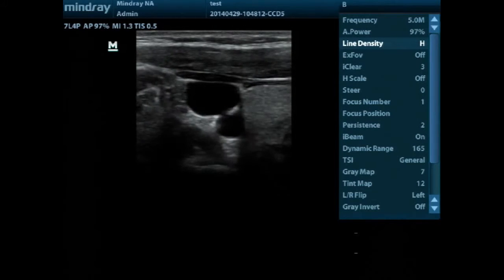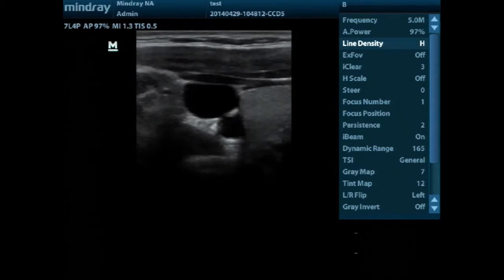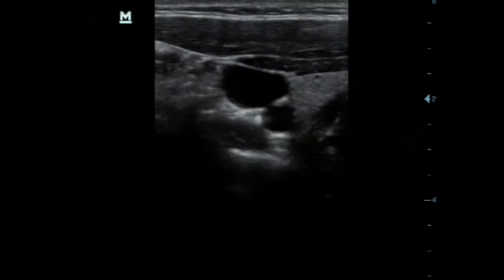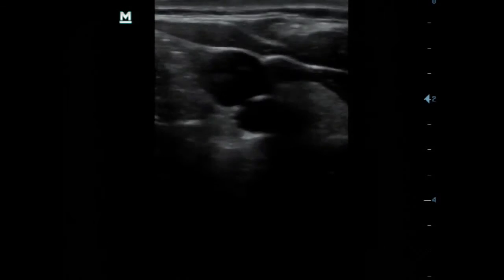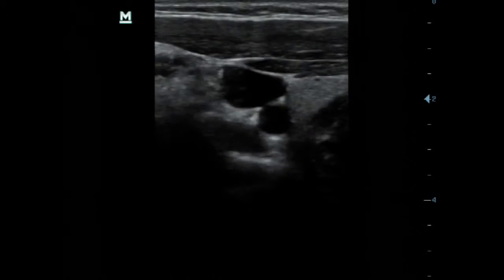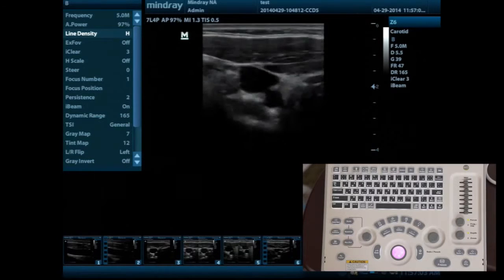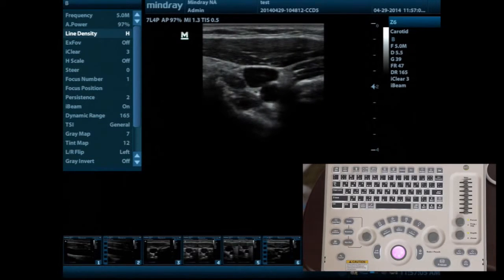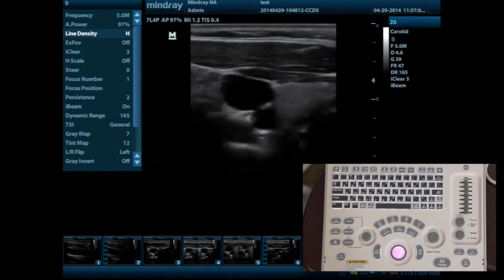So you're not zooming in, so you don't lose any pixels. It actually keeps the image nice and sharp. And so this is like a medium, and then if you hit F1 again, the iZoom, then you go full screen. Oh, I see. You have the ability to go between a normal size, a medium, and a full upsample to large screen. If you press it again, you'll see that the F1 key becomes non-backlit orange and is back to where you see your images saved along the bottom and your patient information on the banner.